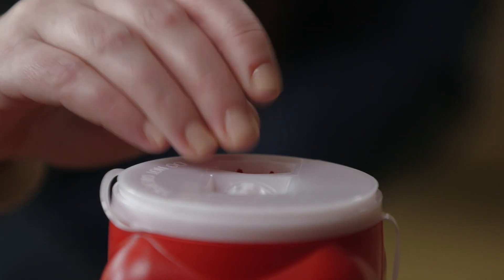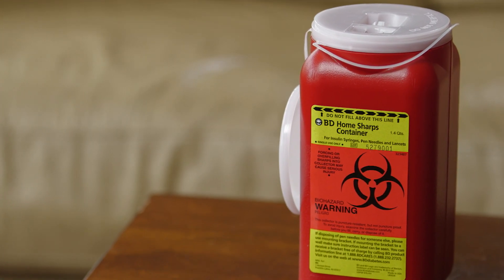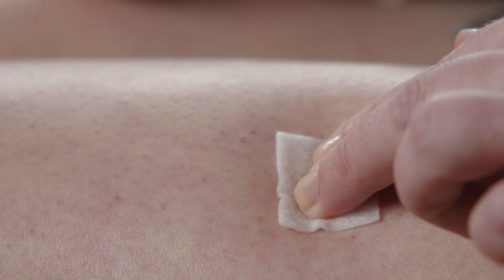It's very important to discard the used syringe into a home medical sharps container or an approved container by your local sanitation service. If slight bleeding occurs, you may apply gentle pressure over the area for a few seconds.